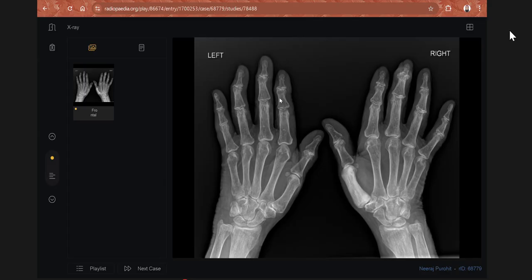So you see the sclerosed metacarpal of the right thumb. Then what is your other differential? Your first differential was psoriatic, and you say sausage finger. I think if you see, both thumbs are comparable in size. So what do you think other than this psoriatic arthritis?